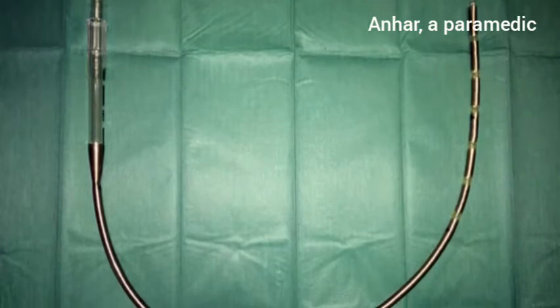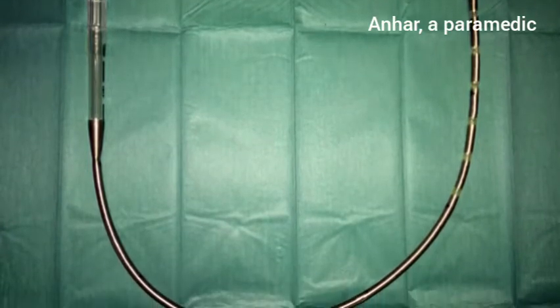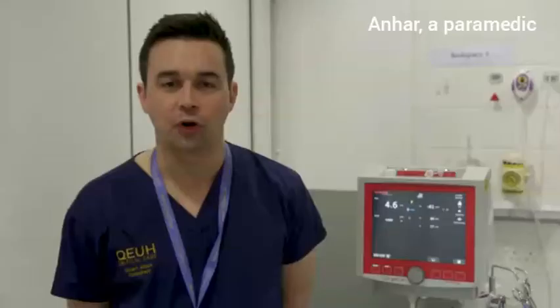Clearly, there must be an interface between the patient's venous system and the ECMO circuit, and that comes in the form of cannula. Various forms of ECMO cannulae are available. However, they are all large bore to allow the high blood flows required by ECMO, and they are inserted either via the jugular or femoral veins.